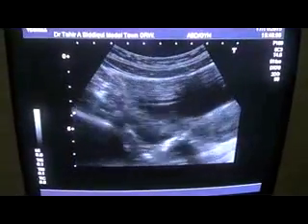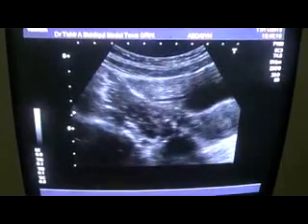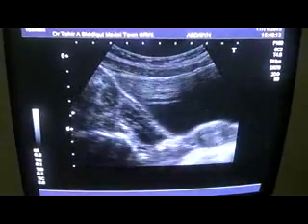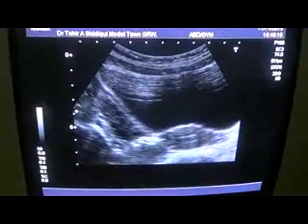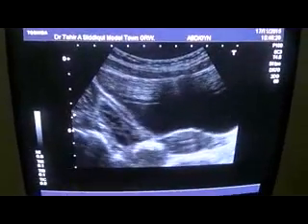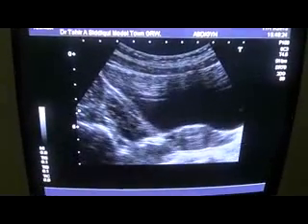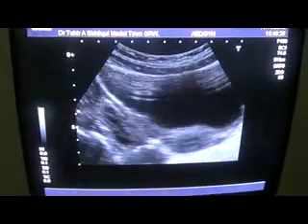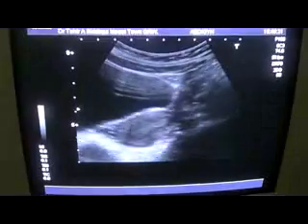Try to bring it to the center of the screen and give it a sweep to see where the follicles are. In this case the follicles are seen throughout the ovary, and the ovarian stroma is seen. Now let's move towards the left side using the same procedure.